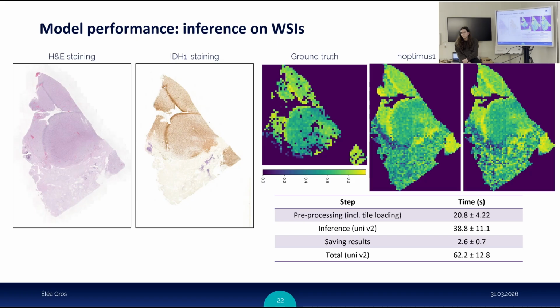In such cases, you would need something like a gliometer to tell you, in this area, it's a low-grade glioma, the tumor cell content is not very high anyway, but in this area you have 20% and not 5%, so you have more chances to be able to find a mutation or a fusion, so more chances to make a diagnosis. This probably will come as a comment.